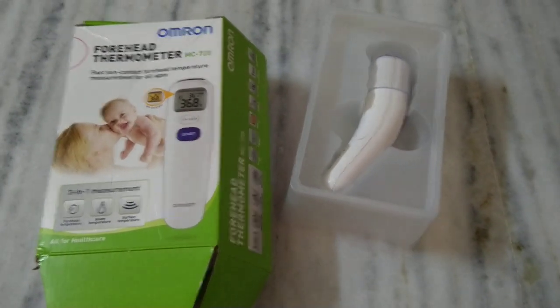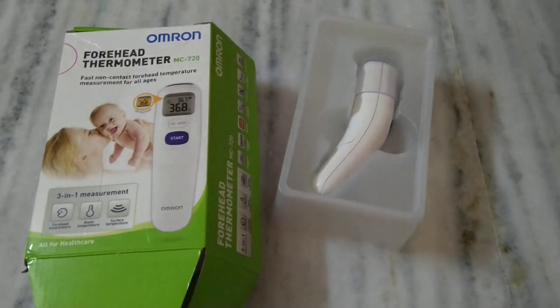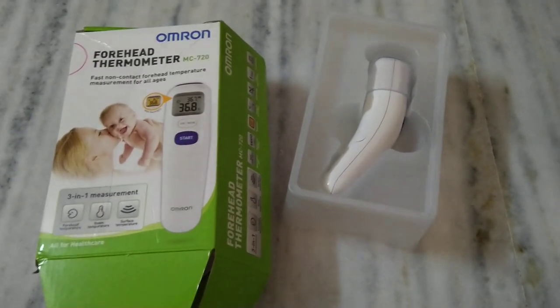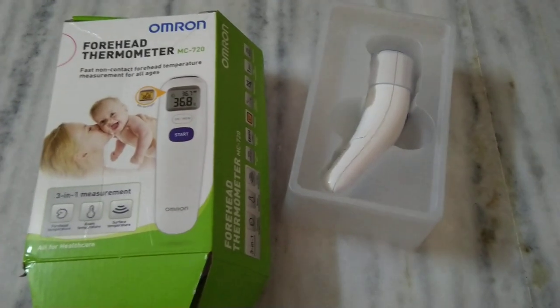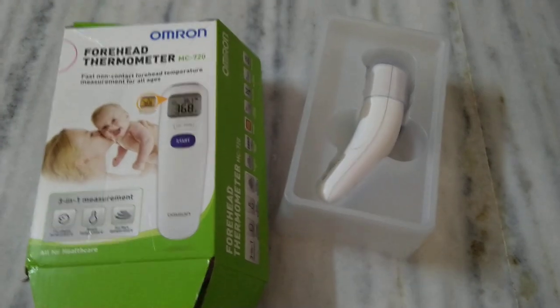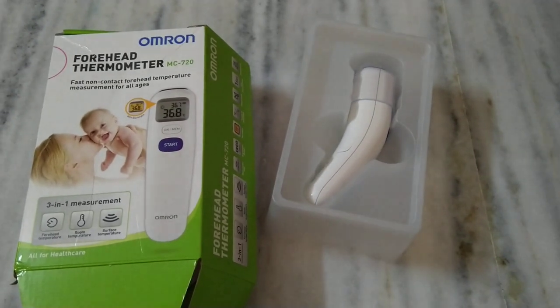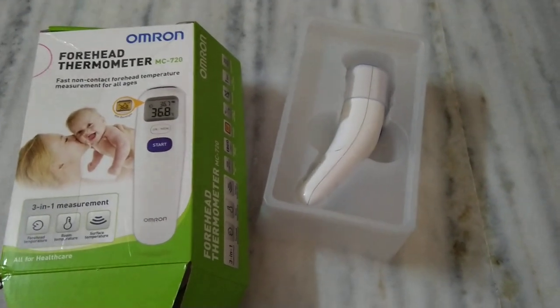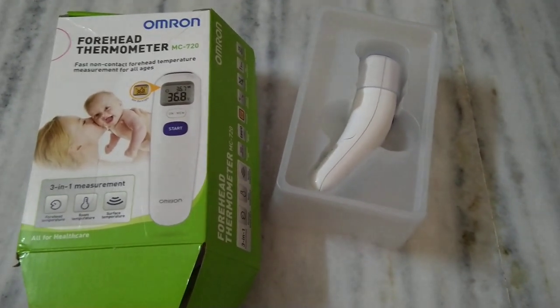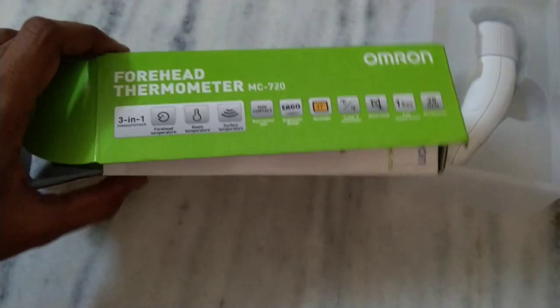I researched which is the best temperature monitor available online and finally decided that Omron is the best option. This one is a bit on the pricier side because it is imported from Singapore — it cost me around 1800 rupees — but other products were available for only 1200. I couldn't rely on those because false readings would lead to false treatment, so I chose Omron as a reputed brand.